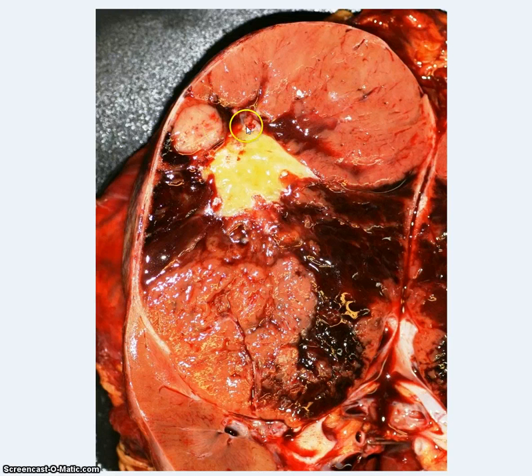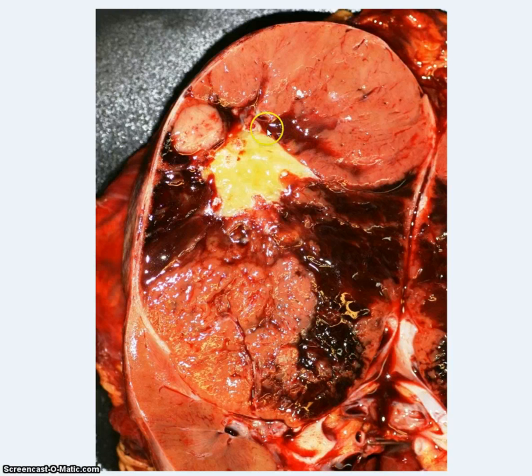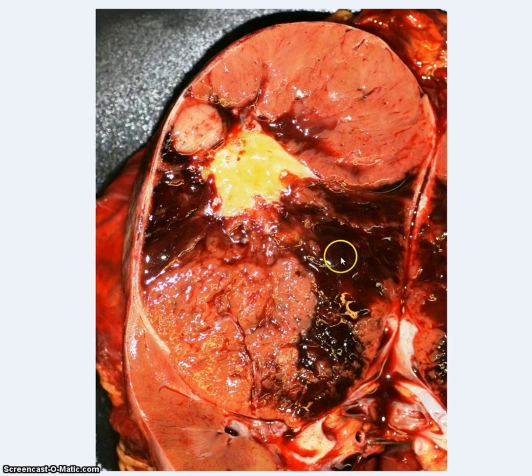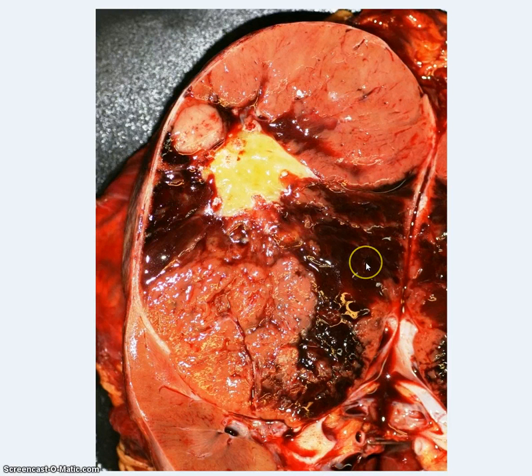But the other thing of note is this central, really quite bright yellow area. And this is what's described as a stellate scar. These other areas around here on either side are areas of hemorrhage within the tumour.